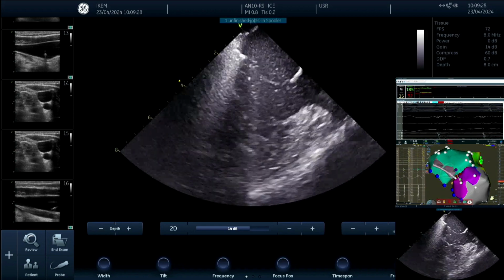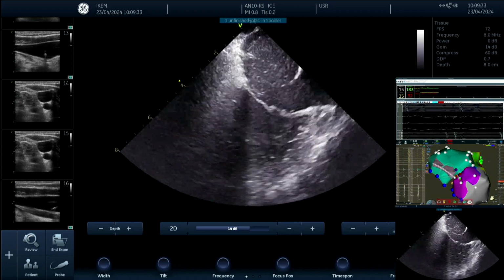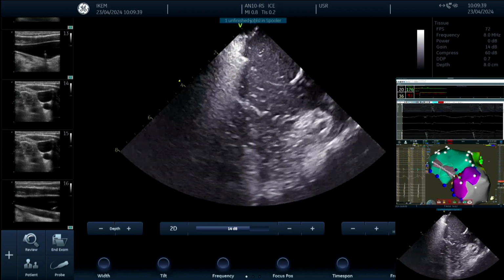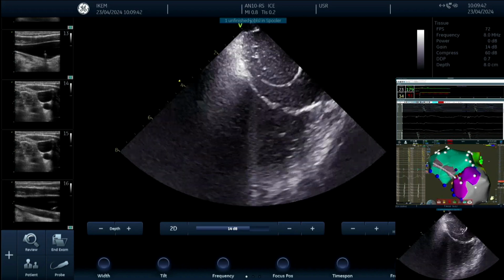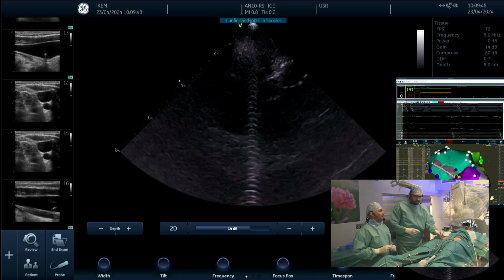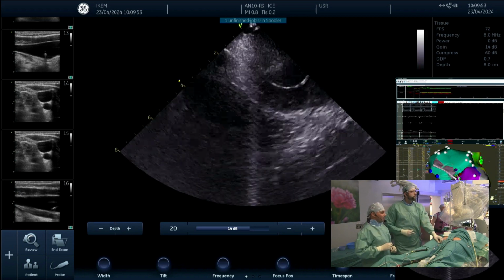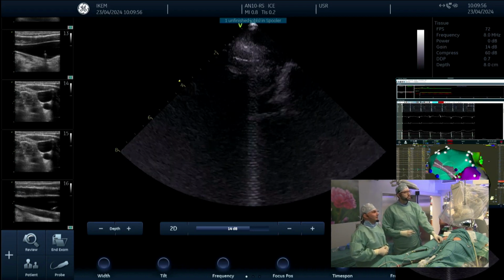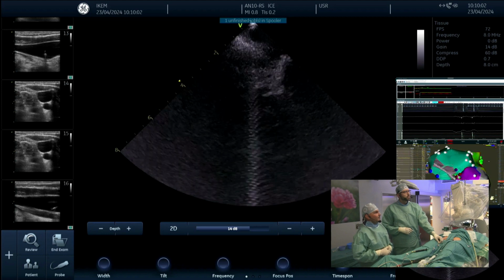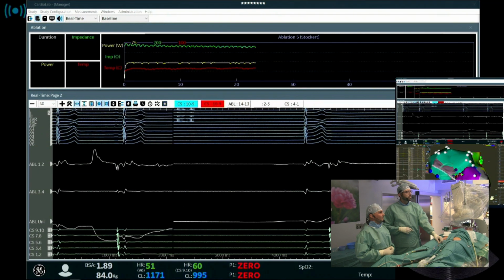And so based on our preliminary experience, it looks like if you really isolate very durably the pulmonary veins and you do lines which are also durable, or you completely erase the posterior wall, it probably is more important than GP ablation for AFib recurrence or no recurrence. But we have to see. But this is an example of how we can now use pulsed field together with extracardiac vagal stimulation, and compare with thermal energies, to give us more answers about the role of GP ablation for AFib ablation.